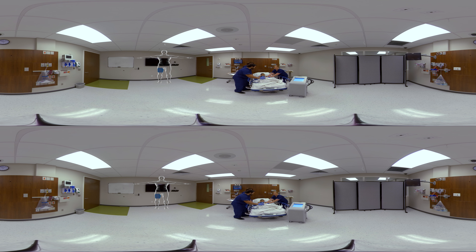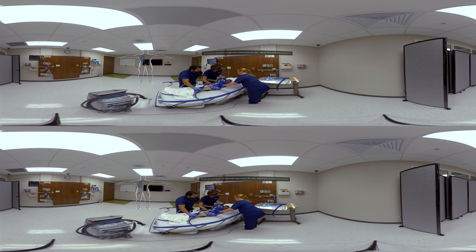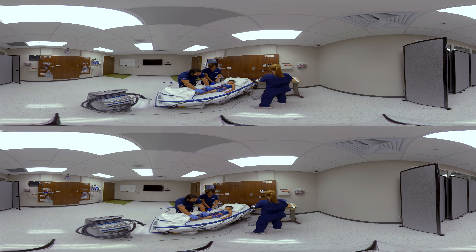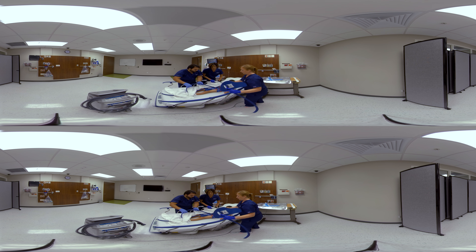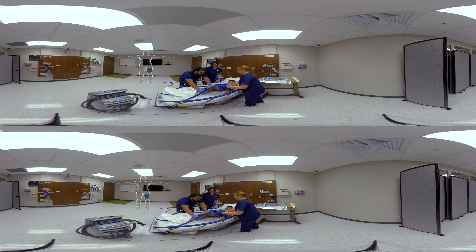You want to make sure you never cut the pads. Now we can roll Cruz to the other side. To place the torso pad, we're going to line the long straight edge up next to the patient's spine, allowing for a couple finger width distance between the two pads, then wrap it around the torso and roll the patient supine. To place the thigh pad, we'll simply bend the knee, line up the hoses anterior to the patient pointing towards the patient's feet, and wrap it around underneath.